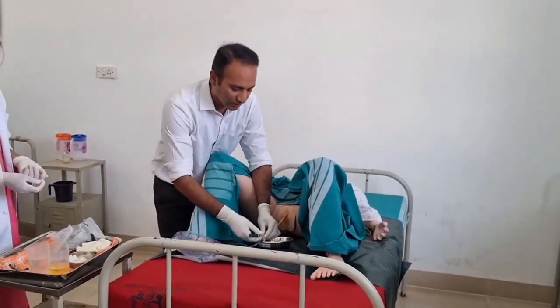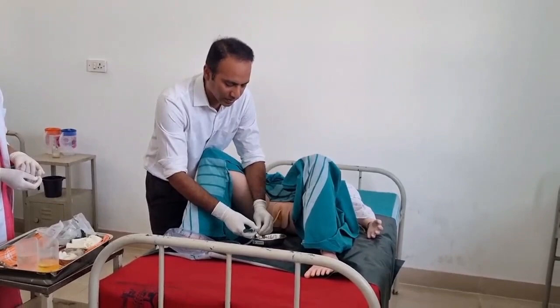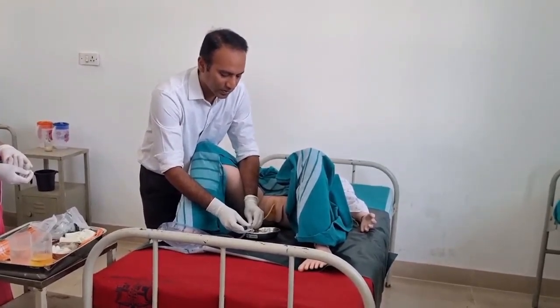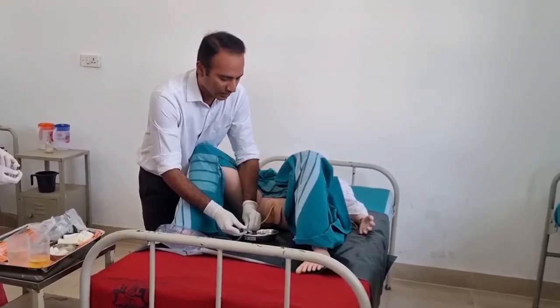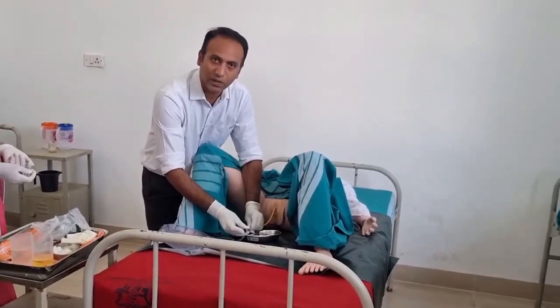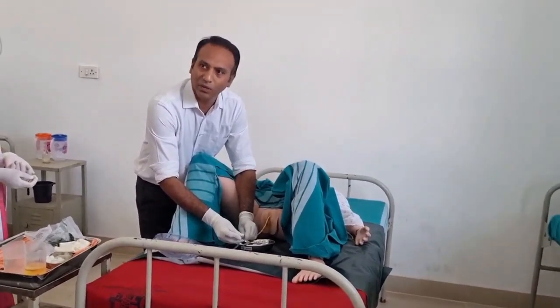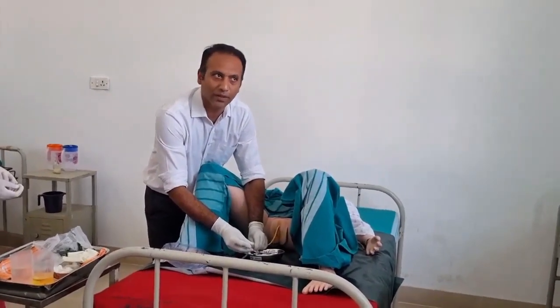Because if you are not on duty and the patient is discharged, another nurse may assume the inflating volume was around 5 ml and she may withdraw or aspirate only 5 ml.